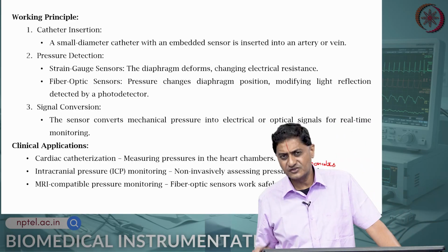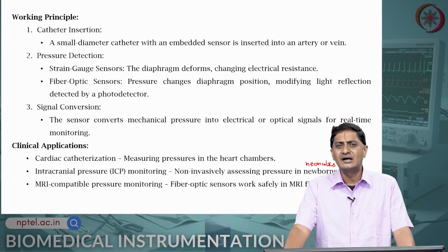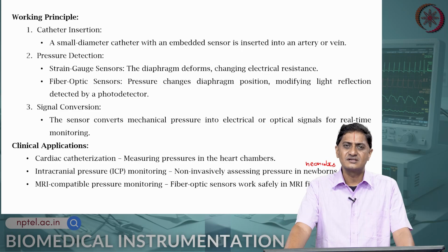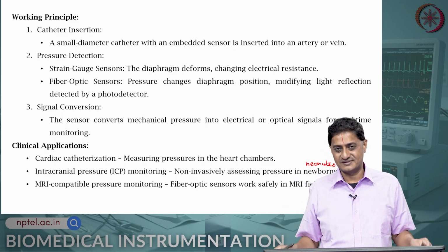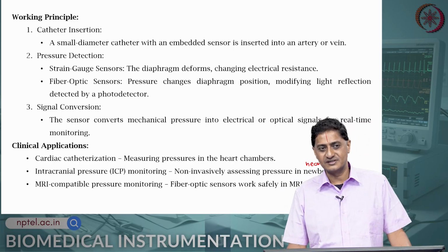Current research in this field is focused on developing an array of sensors, several sensors that detect pressure, so that we could try and map to a true pressure value using multiple sensors. So, you can have a matrix of sensors, an array or matrix of sensors that is being used.